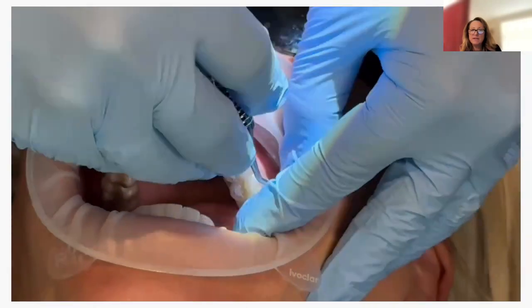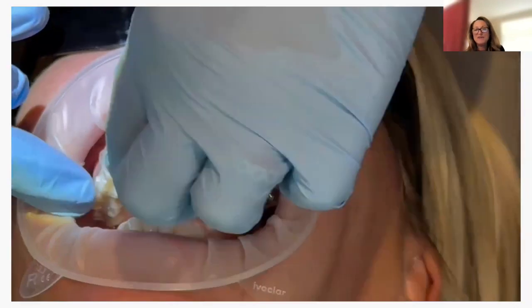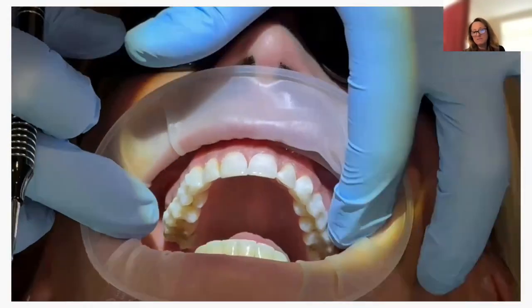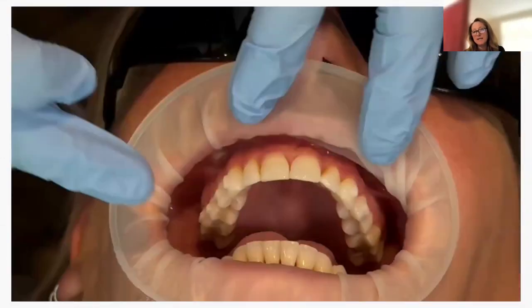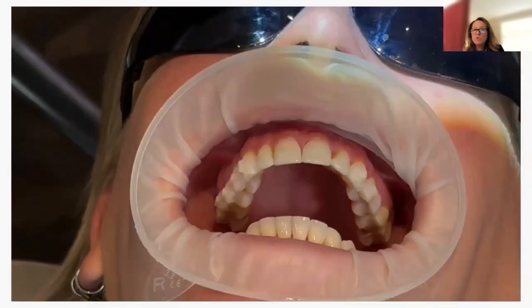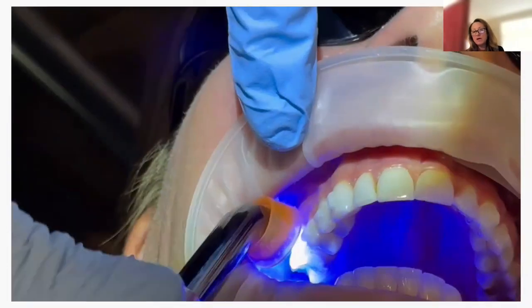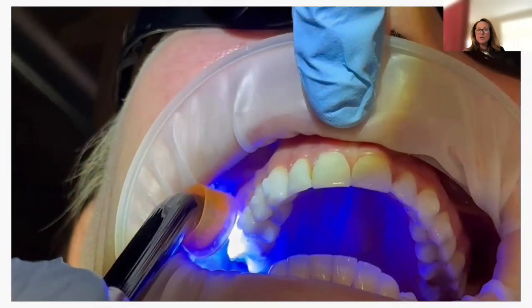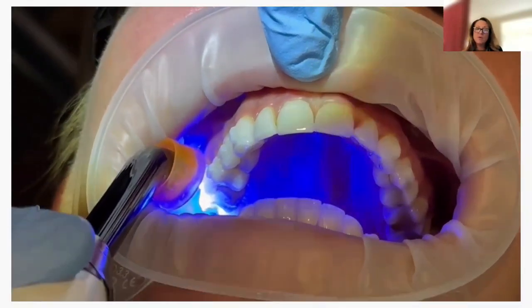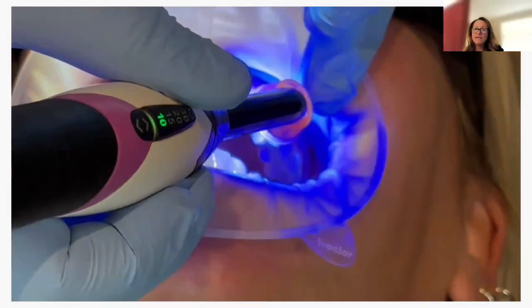And you'll see here, I don't know if it shows it. Trying to see if you can see it. Do you see the attachment was in the aligner still? So it came debonded on number 14. So different aligner companies, on your template, they'll say that you can cut. So Dr. Witten, she usually cuts hers in half, and you'll see on the lower when we get to that point. But I'm going to have you look at the different shapes of the attachments.